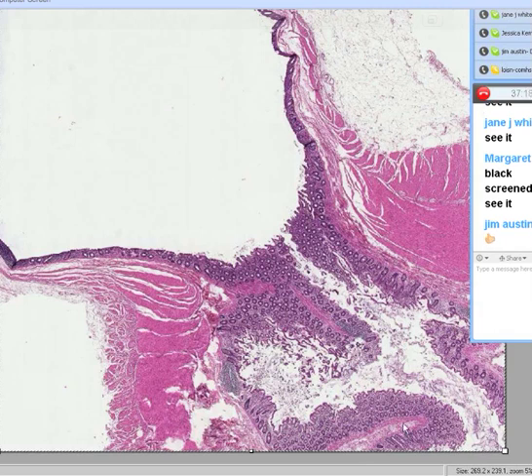You can see a little submucosal projection, which is, if you remember in the colon, they're called haustrae. Just like in the small bowel, they're called plicae. Just like in the stomach, they're called rugae. And that's basic anatomy, folks. You don't have to know pathology to know that. And then you have your muscular layer.